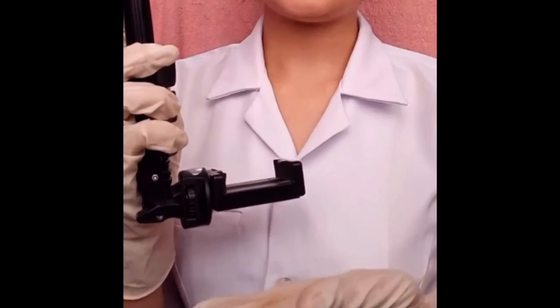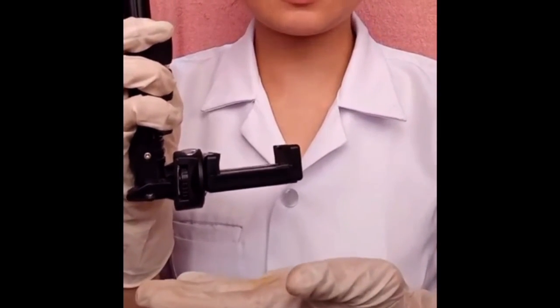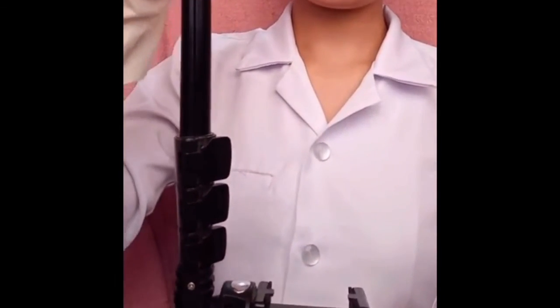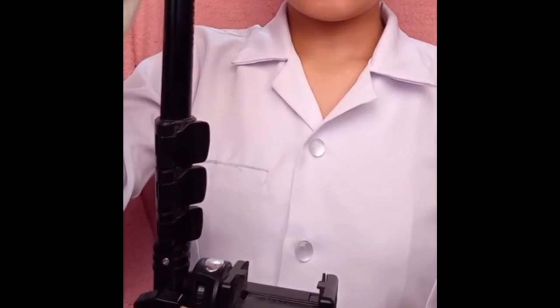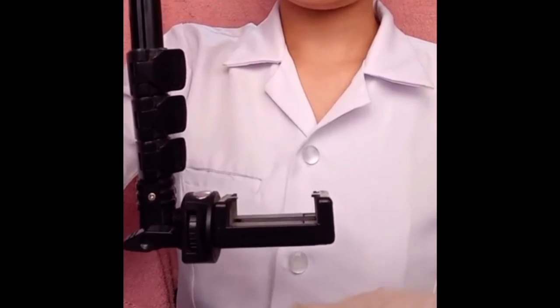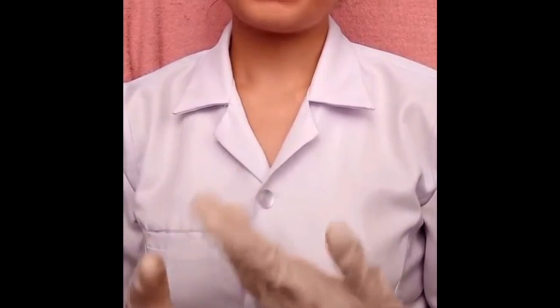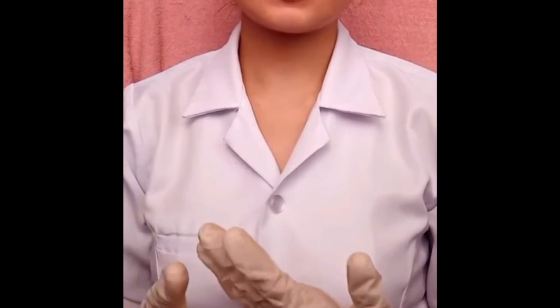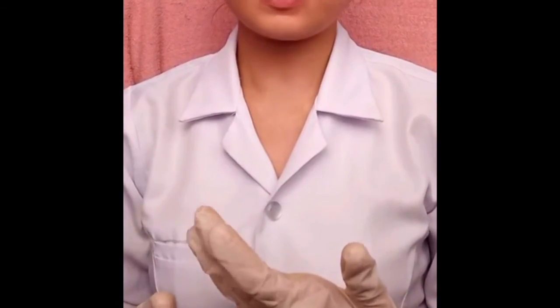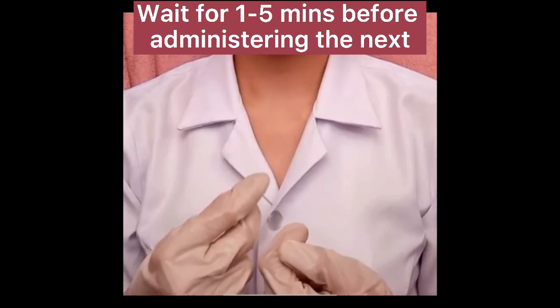Next is to have the patient place the spacer's mouthpiece into the mouth, grasping securely with the lips and the teeth, and then have the patient breathe normally into the spacer. Next, the patient should depress the canister, releasing one puff into the spacer, and breathe in slowly and deeply through the mouth. Then instruct the patient to hold his or her breath 5 to 10 seconds or as long as possible, and then to exhale slowly through pursed lips. Then wait 1 to 5 minutes or as prescribed before administering the next puff.